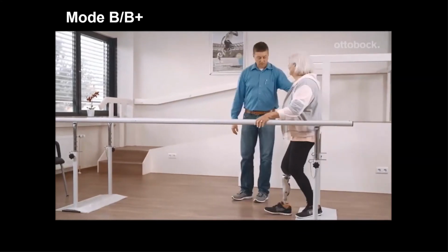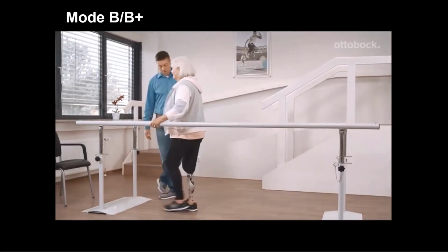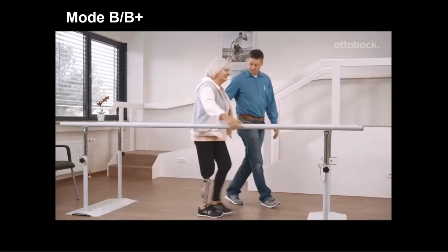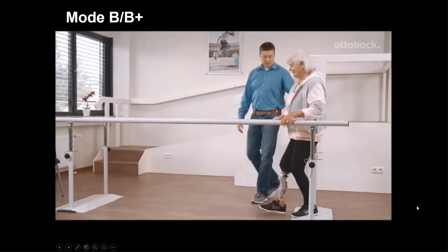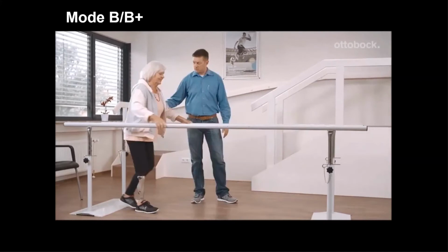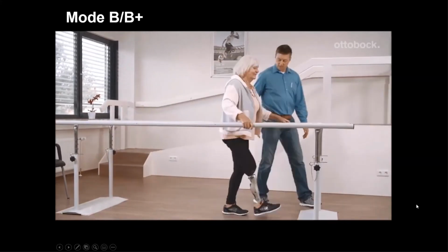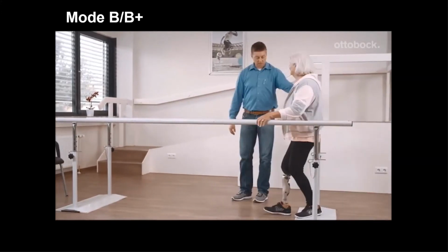And the difference between mode B and B plus is that the knee in the B plus mode will allow for 10 degrees of stance flexion to occur and then block that 10 degrees. So it's not a yielding knee. It goes to 10 degrees of flexion and then blocks it. So the individual can get used to walking with stance flexion. It also helps them going down shallow ramps with this mode. So this is great to train a user.